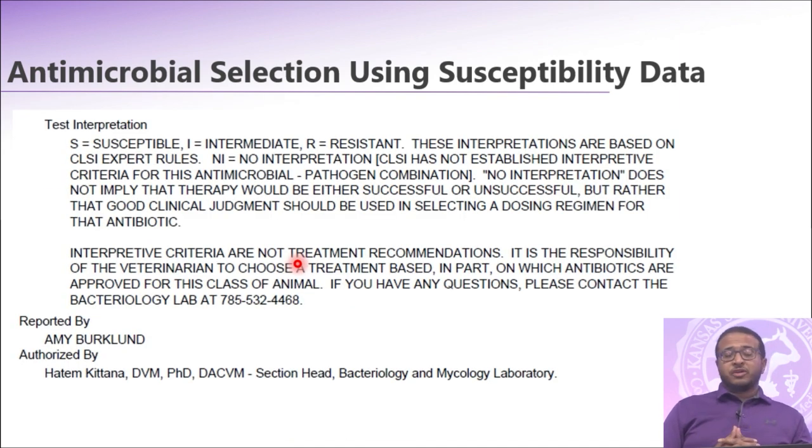And then, of course, it's very important to highlight that all our susceptibility testing that we share and discuss with our clients and veterinarians comes with a standardized comment that this is in vitro testing, right? It's one of the very important tools that we use as veterinarians and clinicians to determine which antibiotic we're going to actually use for treatment.